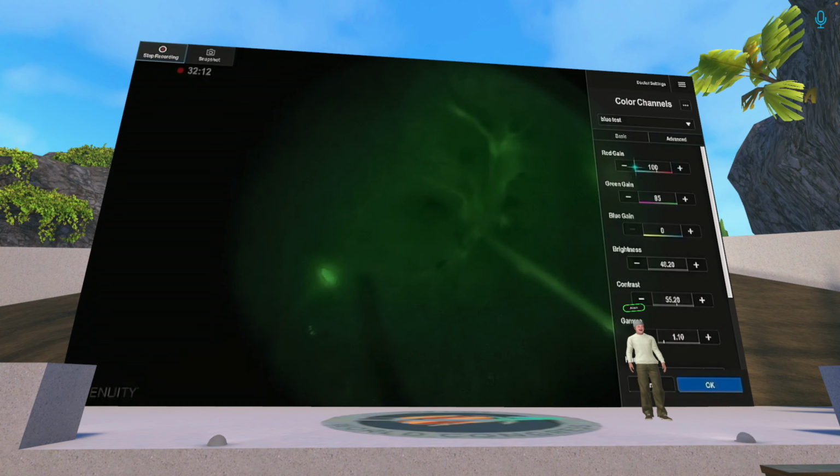No, I agree. I think we certainly need a section on optimization and standardization of what we're all doing. The one thing that does make it a little more difficult is that different people have different microscopes, and we just have to be cognizant of that, because not all microscopes are created equal.